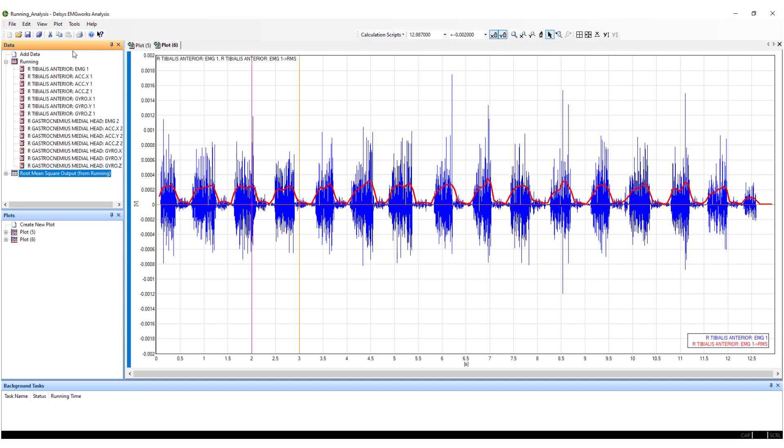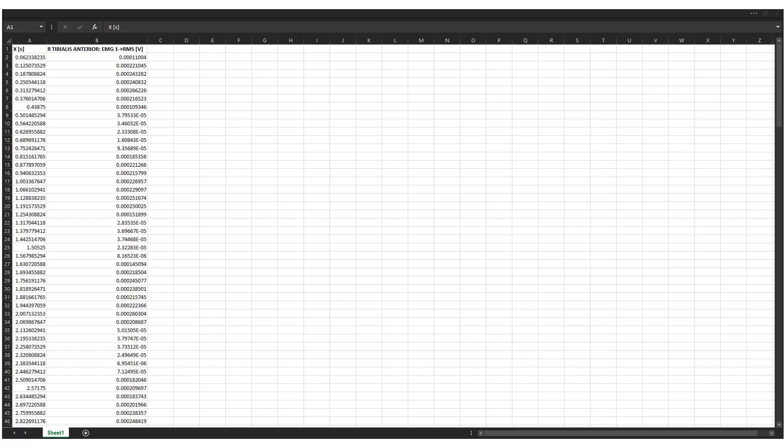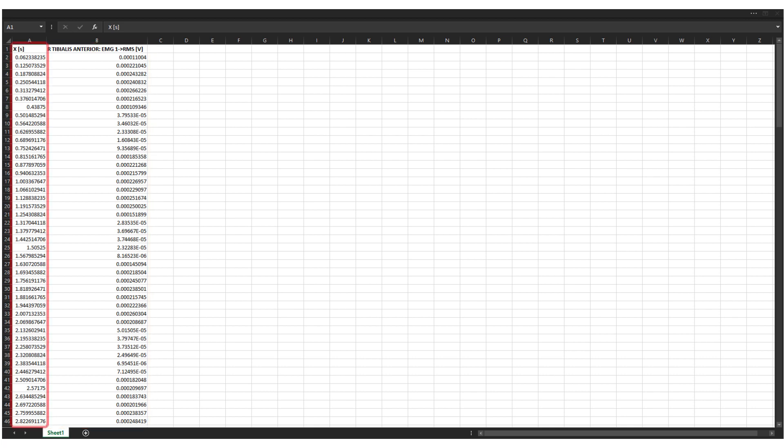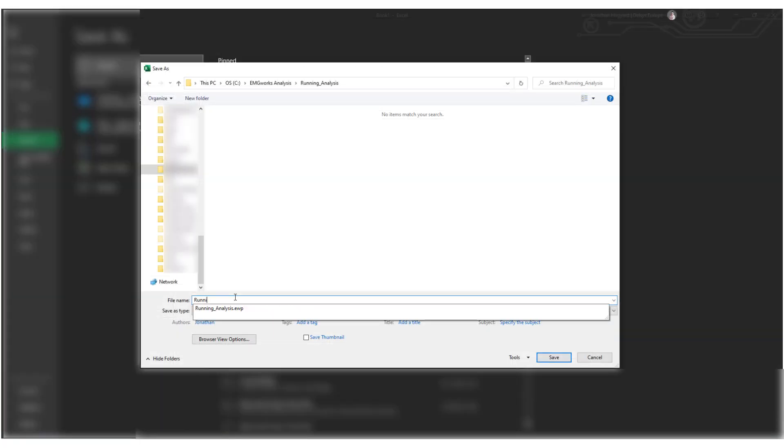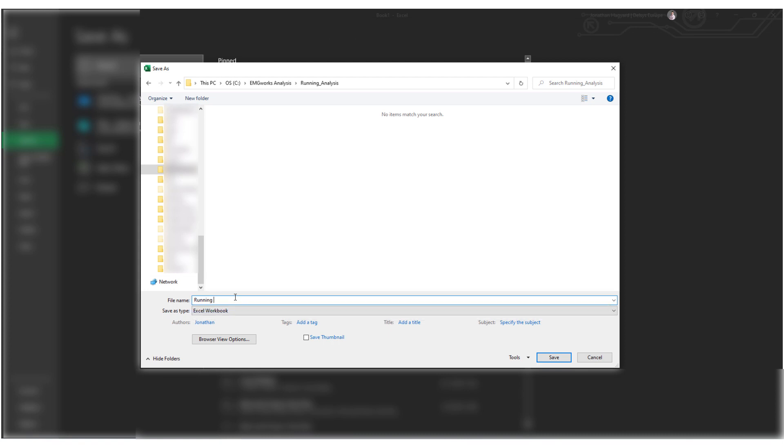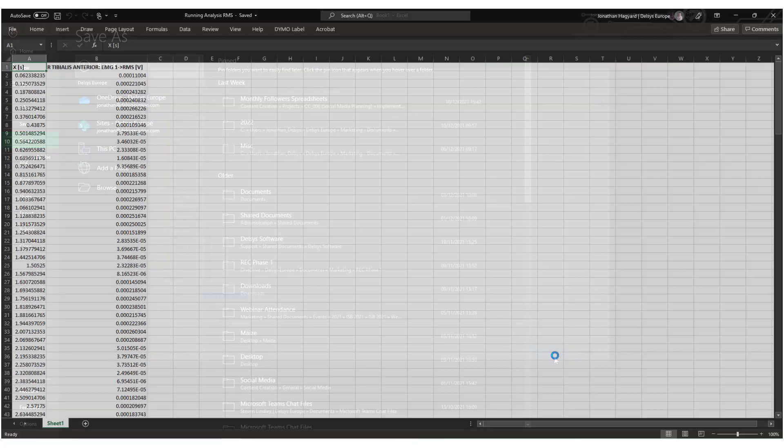The exported Excel file will automatically load. The data file will be shown with each data channel listed next to the individual timestamp based on the channel sampling rate. The CSV file can be saved within the same file directory as the EMG Works Analysis workspace.